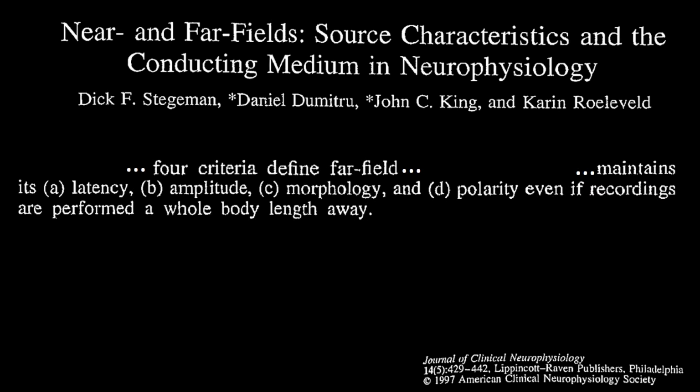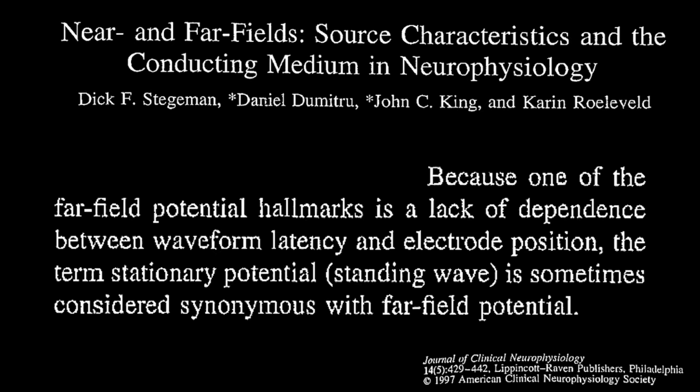In the same article, far fields are also defined. Far fields are defined as maintaining their latency, amplitude, morphology, and polarity even if recorded from far away distance, and they make the point of saying that even if it is performed a whole body length away. A third point made in this article is that far fields lack dependence between waveform latency and electrode position, so the term stationary potential is sometimes considered synonymous to far fields.